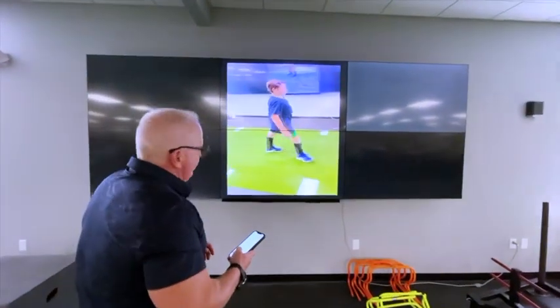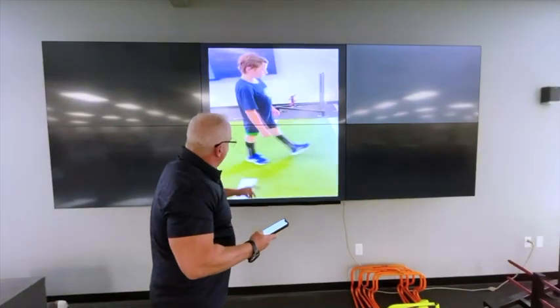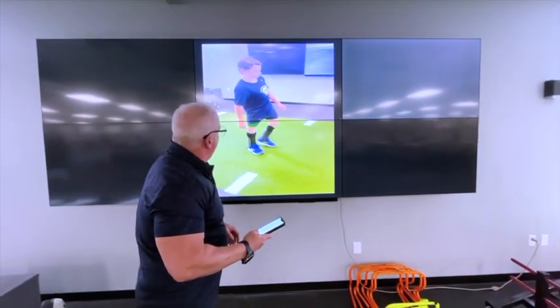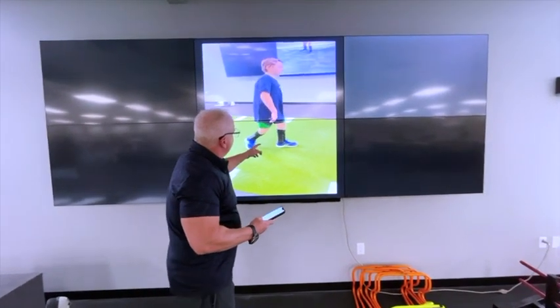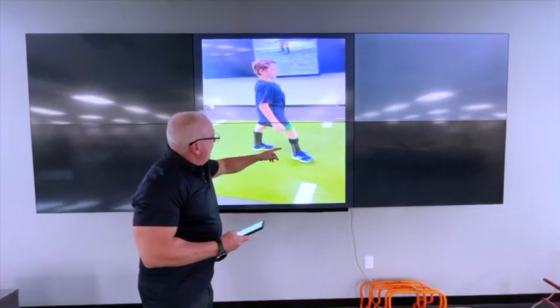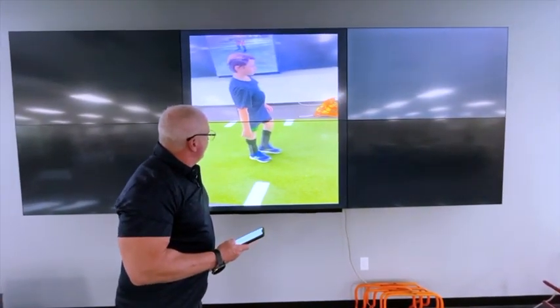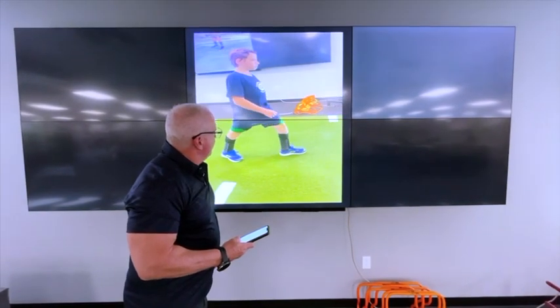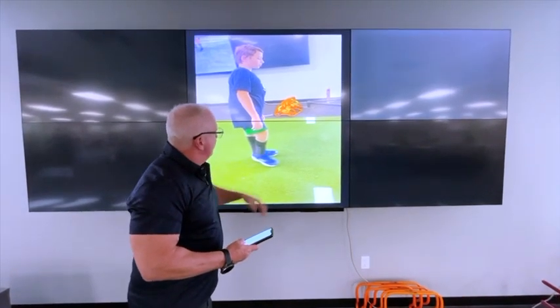So this is a spina bifida patient that we saw, has zero motion at his ankles. He's in conventional type AFOs. And so if we're watching him walk with the AFOs, we can actually see when he takes a step out here, as he stabilizes, his knee goes back into extension, almost really hyperextension. And so on every step he does that, and then what he'll do is he throws his hip around to allow him to get through it.